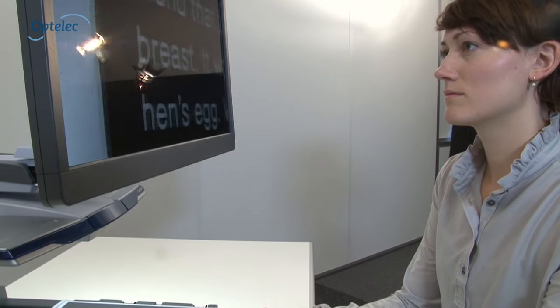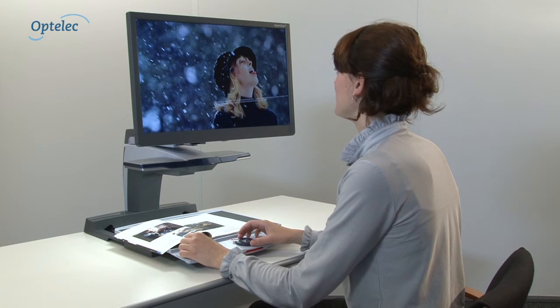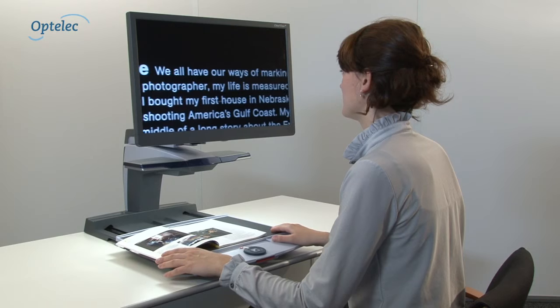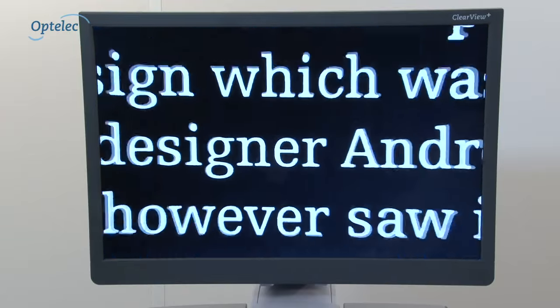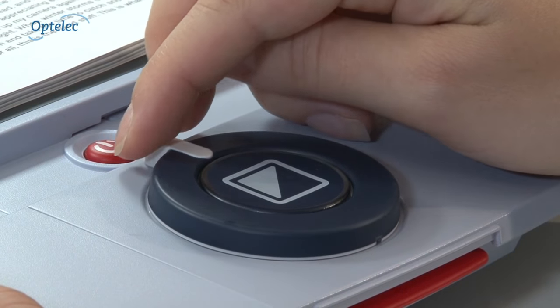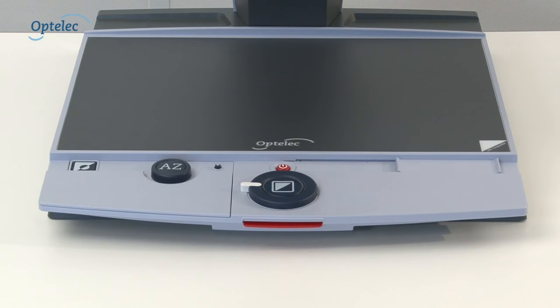Are you experiencing difficulties with reading your post and viewing family photos? The Optelec Clearview Plus is an electronic video magnifier which can enlarge text and images. Optelec Clearview Plus: from one-button simplicity to endless possibilities.